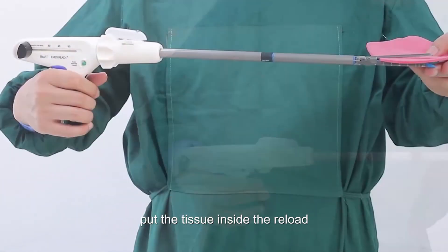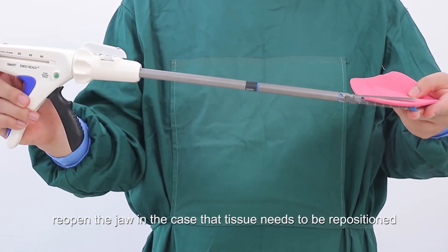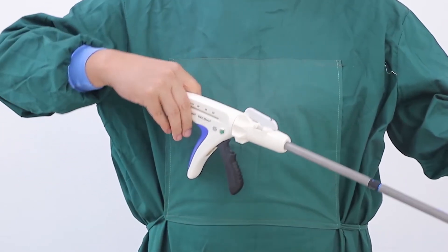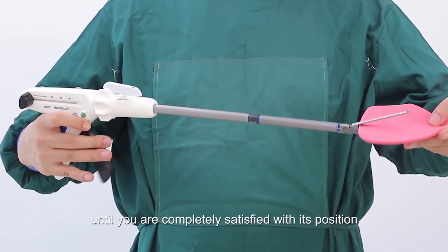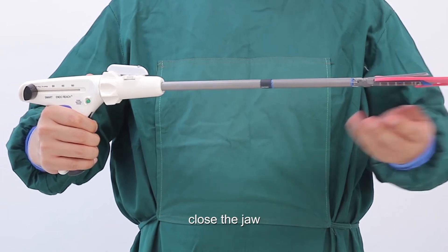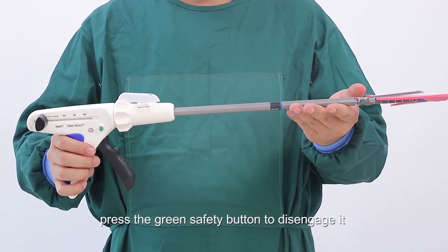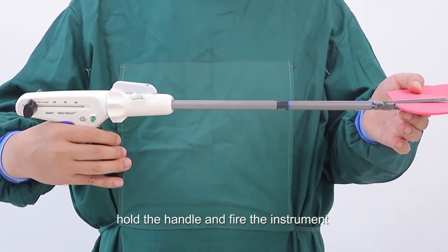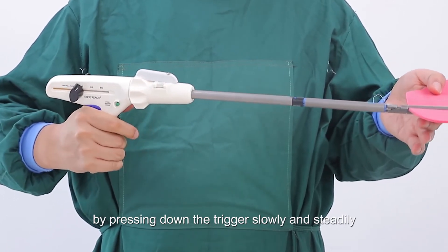Put the tissue inside the reload. Close the jaw by pressing down on the trigger. Reopen the jaw if the tissue needs to be repositioned. Adjust the position of the reload until you are completely satisfied with its position. Close the jaw. Prior to firing, press the green safety button to disengage it. Now you are ready to fire the instrument.